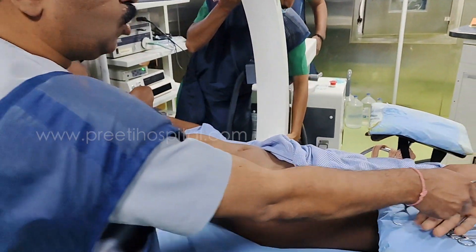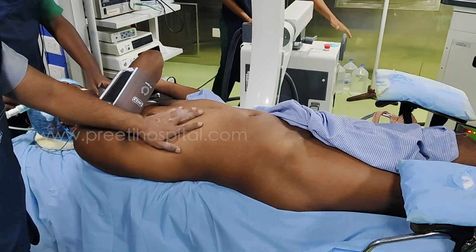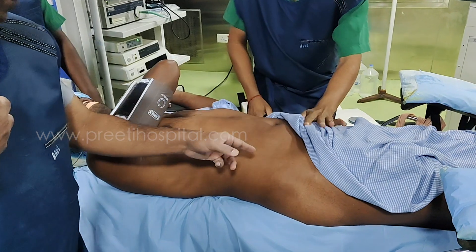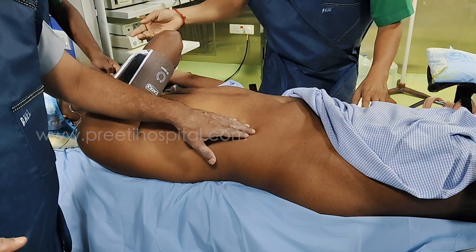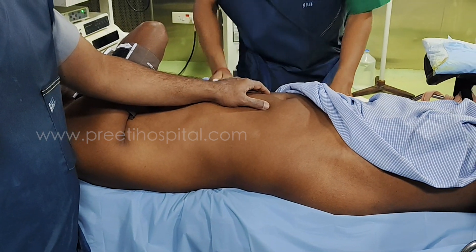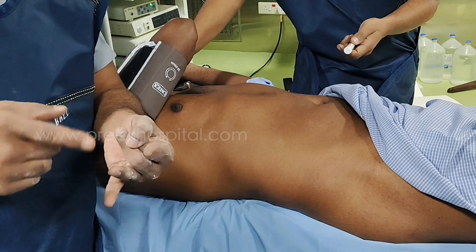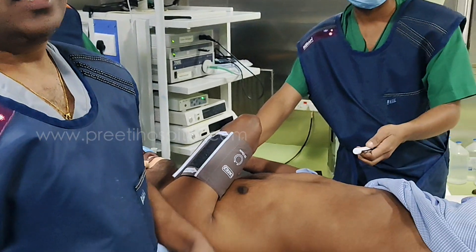Now, regarding patient position: in supine PCNL, the problem is you see 90% of the anterior abdomen, where the kidney is not. That's why we have fear — if you puncture anteriorly, the colon will come 100%. Who can tell where the colon is in this position? Nobody. But one tool can: ultrasound. Keep one ultrasound probe, confirm the colon is not there, then puncture. But how many of us have ultrasound in the theatre? With PNDT Act regulations and maintenance costs, not everyone.